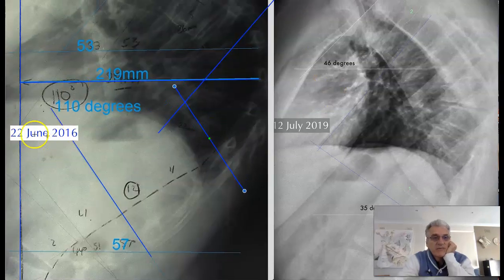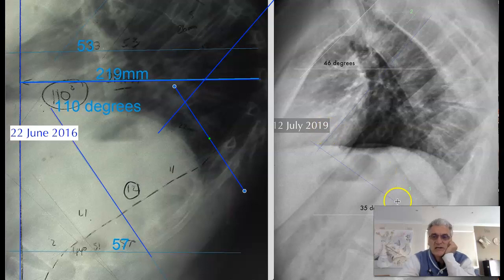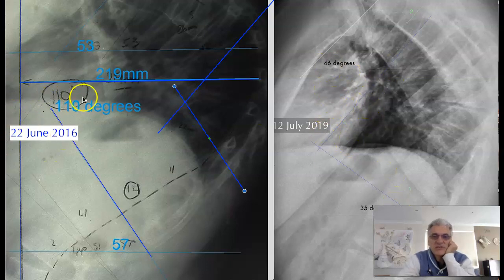Consequently, from the 22nd of June 2016 to the 12th of July 2019, this fellow has an 81-degree curve now, as opposed to a 110-degree curve.